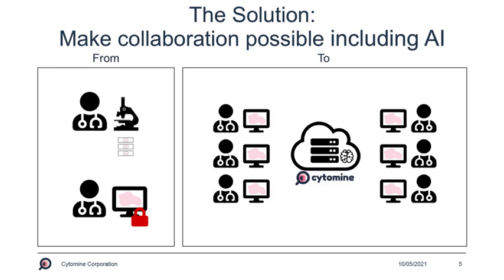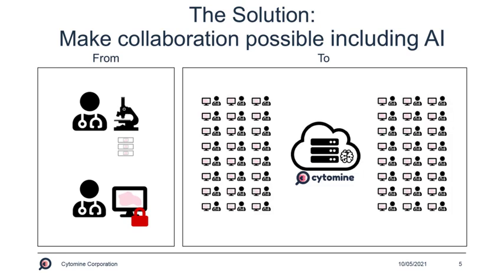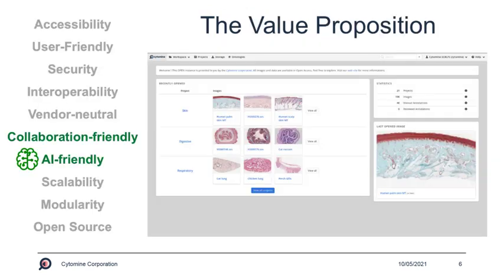The platform has proved to be able to allow collaboration for small teams like tumor boards, but also very big groups, as the record is currently 4,000 people on the same images during a MOOC. We will not spend too much time here on the technical assets of our solution, but we will limit ourselves to mentioning that Cytomine has been developed by pathologists for pathologists, and that we have been really focused on building an application which is collaboration friendly.